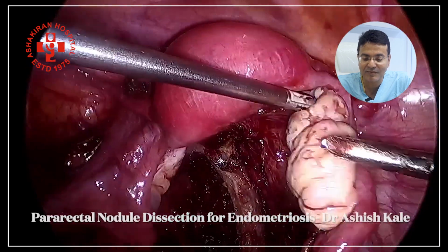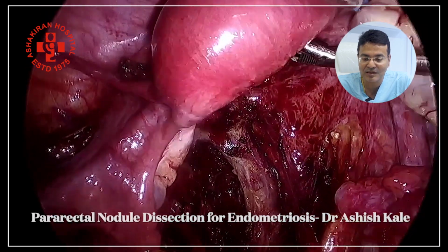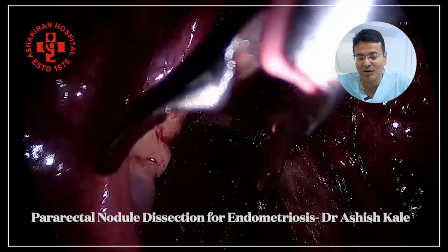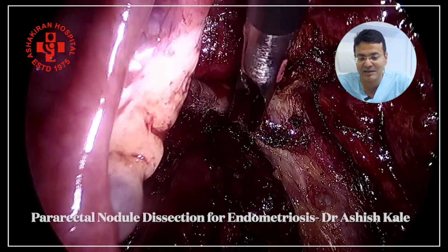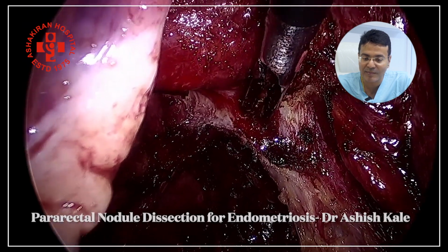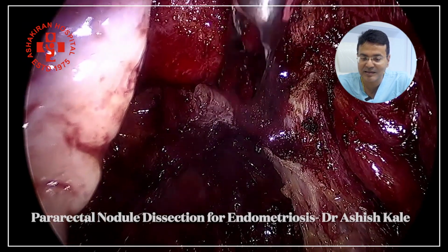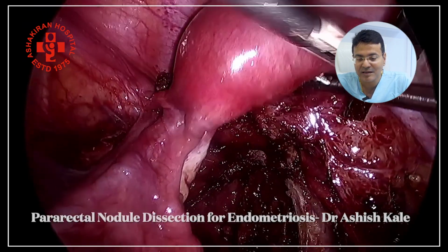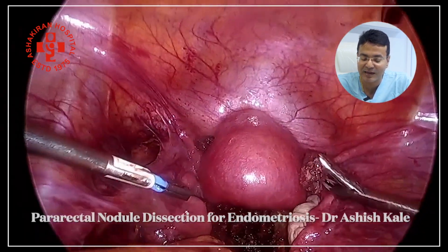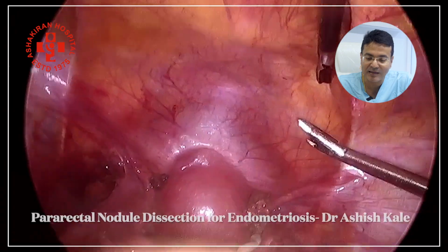These are the final views of both the sides, wherein you can see there is a peritoneum on the right side. We are going to take care of the peritoneum of the broad ligaments on the right side, and the dissection proceeds out. This is usually the bleeding vessels, a minute bleeder from the pararectal area which can be cauterized, and this is the final view.